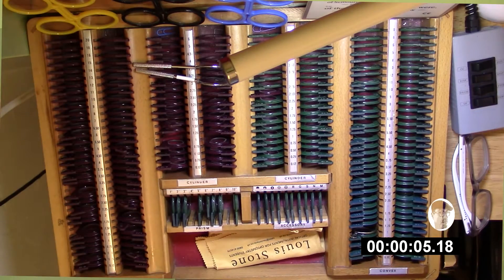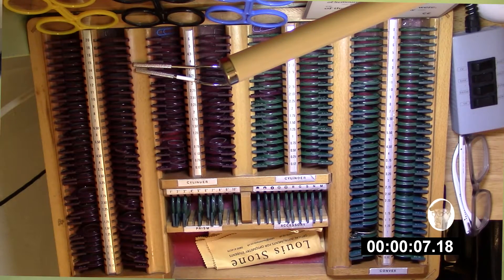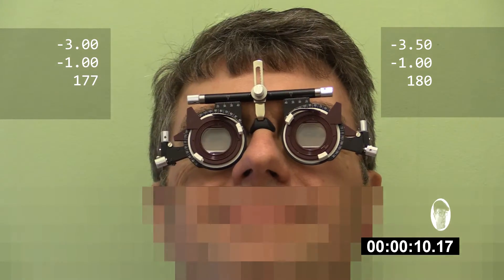Looking at this, the meaty part of the thing is they're not straight on your head. Right side's down, Brianna.